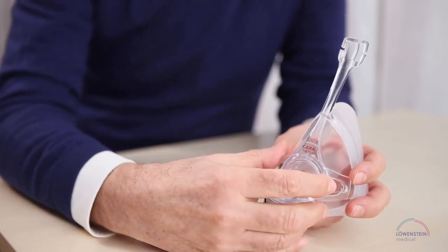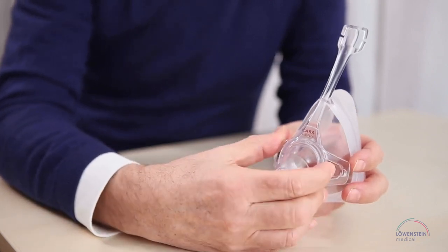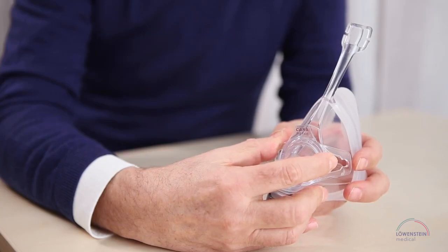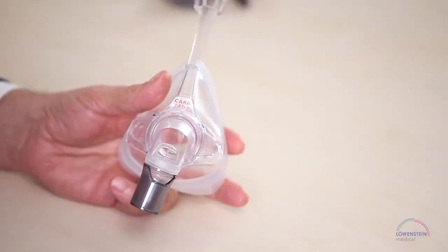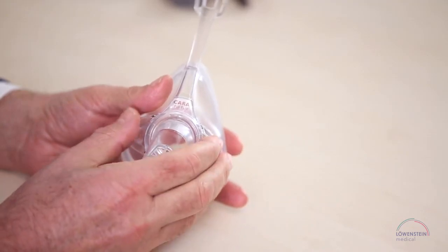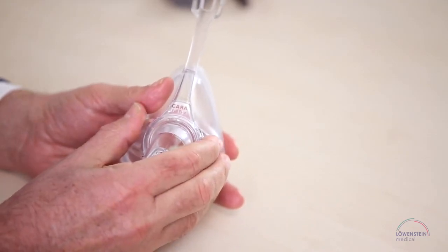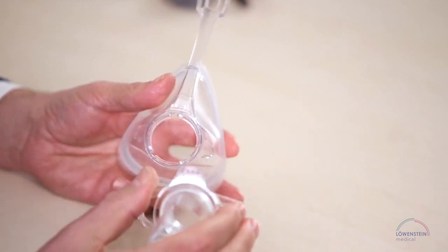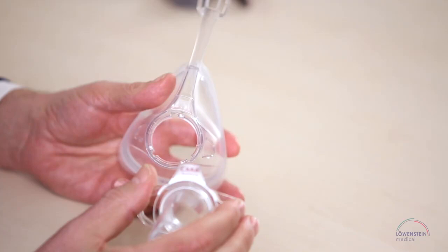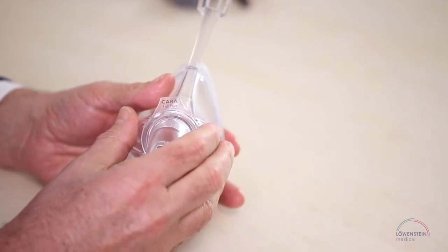You can simply disassemble the plastic parts of the mask for cleaning. Hold the mask body in one hand and the connecting element in the other. Turn the connecting element from 12 o'clock to 11 and pull apart the two plastic pieces. The assembly works the same way in reverse.